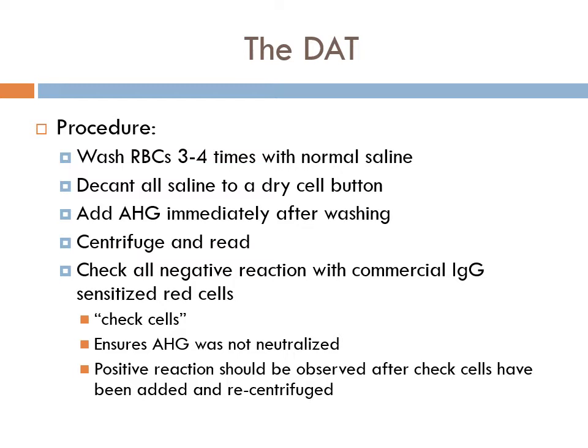Then if it is negative, we're going to check all those with IgG sensitized red cells. They're called check cells. It's going to make sure that the AHG was not neutralized, and a positive reaction should be observed after check cells have been added and recentrifuged.